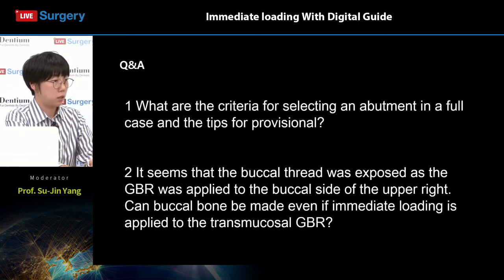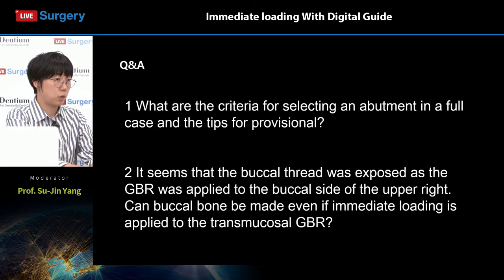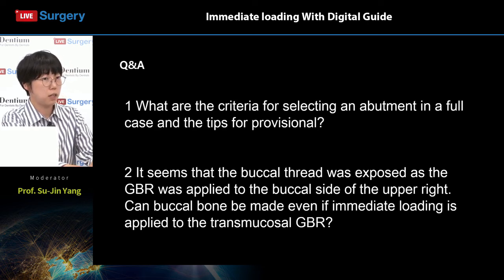And according to what I've done to my patients, this transmucosal GBR with immediate loading shows moderate to very satisfactory outcomes. But still, it isn't a gold standard. So please make sure what the most important factor is when you're performing GBR, and to make sure that your flap is securely put on to or sutured to the site where you have placed your implants and placed your graft material. Okay, I think those were the 2 questions that had come in.